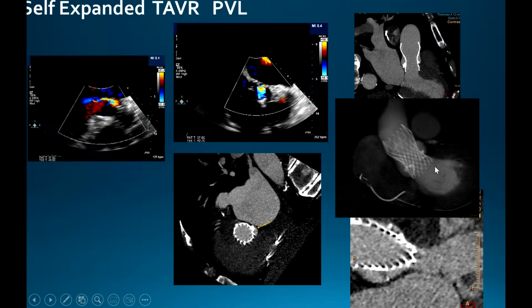And with quasi 3D images, this part looks like it seals pretty well. You probably have a higher chance of finding the gap in this area. And then you need to make sure that what you find matches the area where you see the PVL.